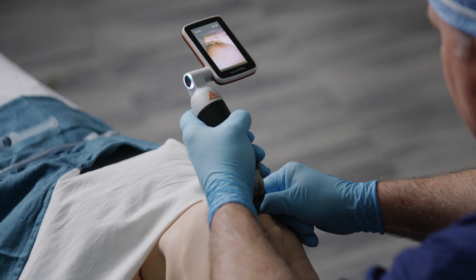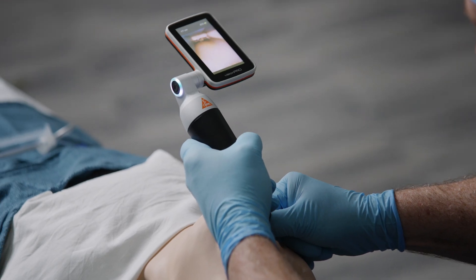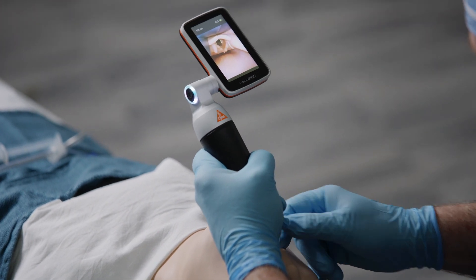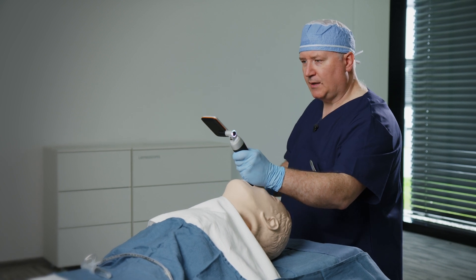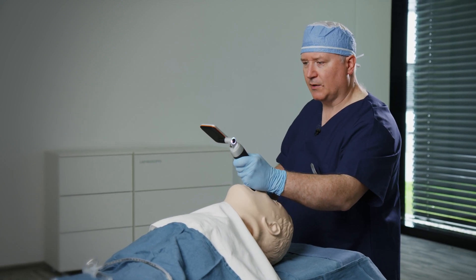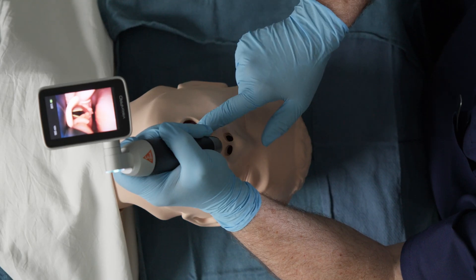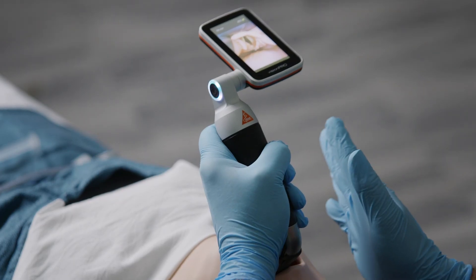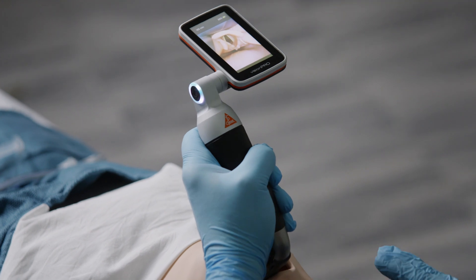I slip from the base of tongue into the vallecular, being very, very gentle. I'm going to use video to make sure I do an absolute perfect job of engaging the vallecular. In this case, I'm looking at a grade one view under direct laryngoscopy, but I'm going to complete this procedure under video laryngoscopy. I now have plenty of room for tracheal tube delivery on the right side of the laryngoscope blade because I came in from the right and moved towards the left, and now I'm pretty much almost solidly midline and I have a wonderful view of the larynx.